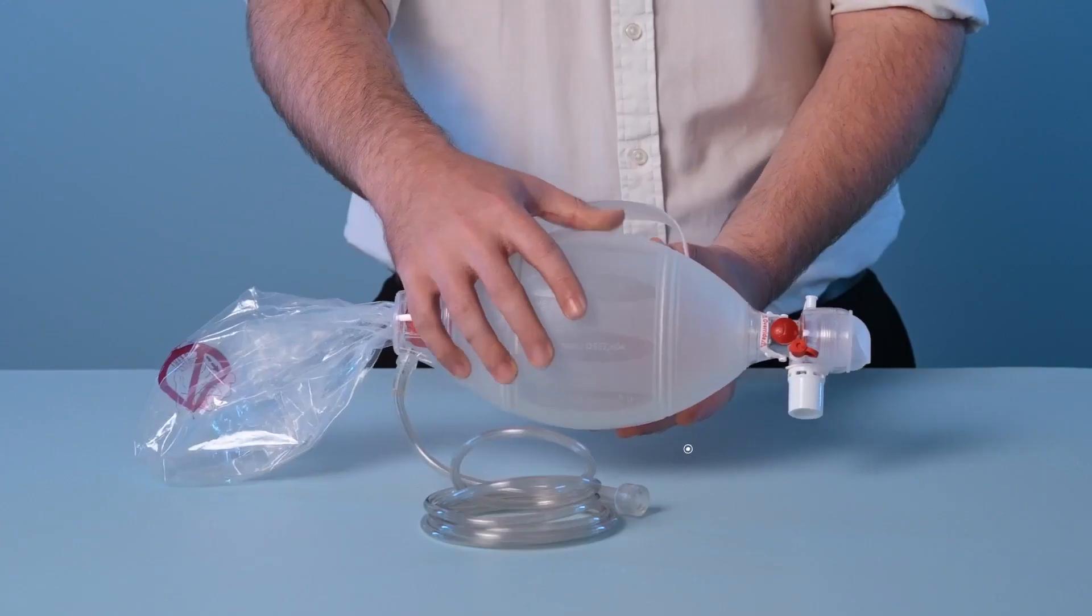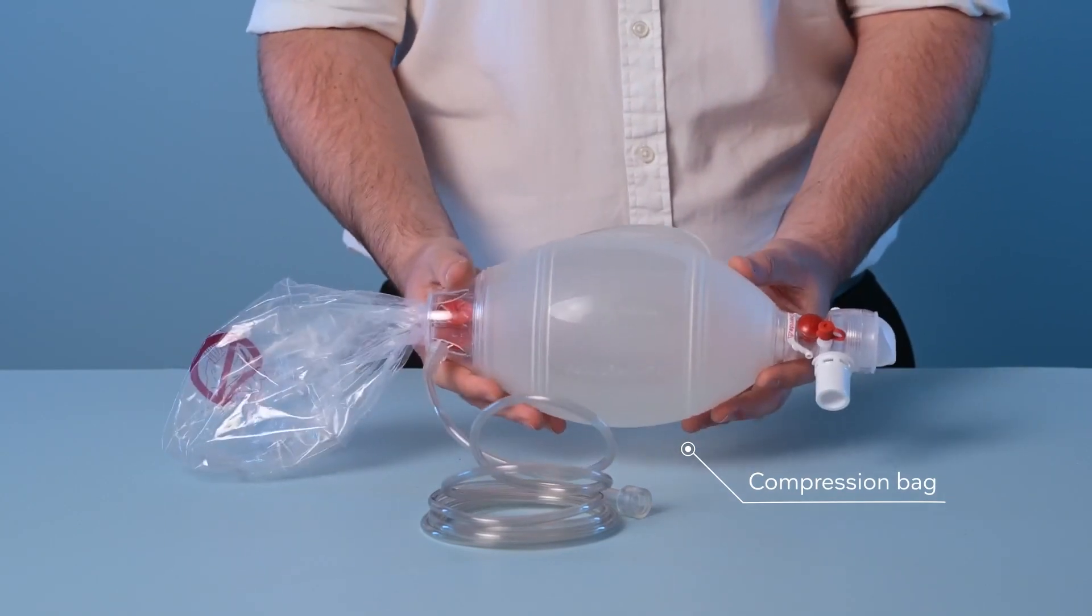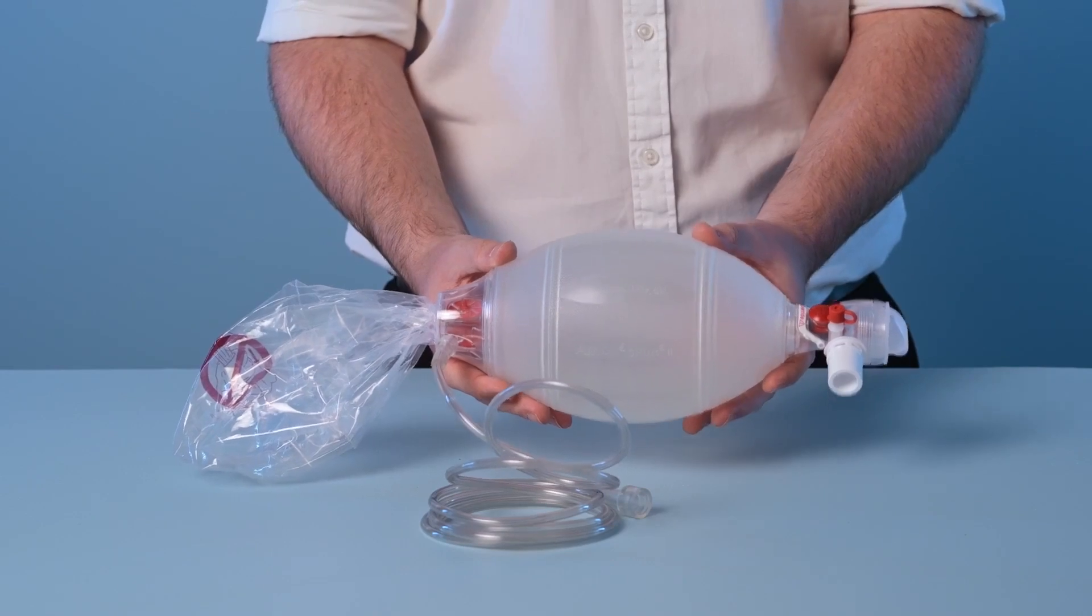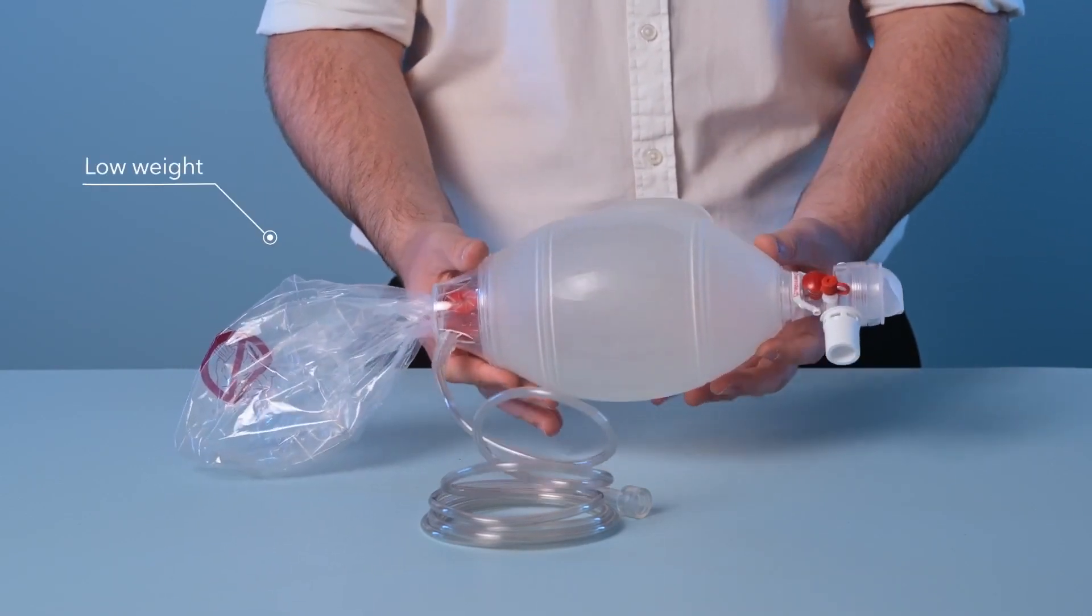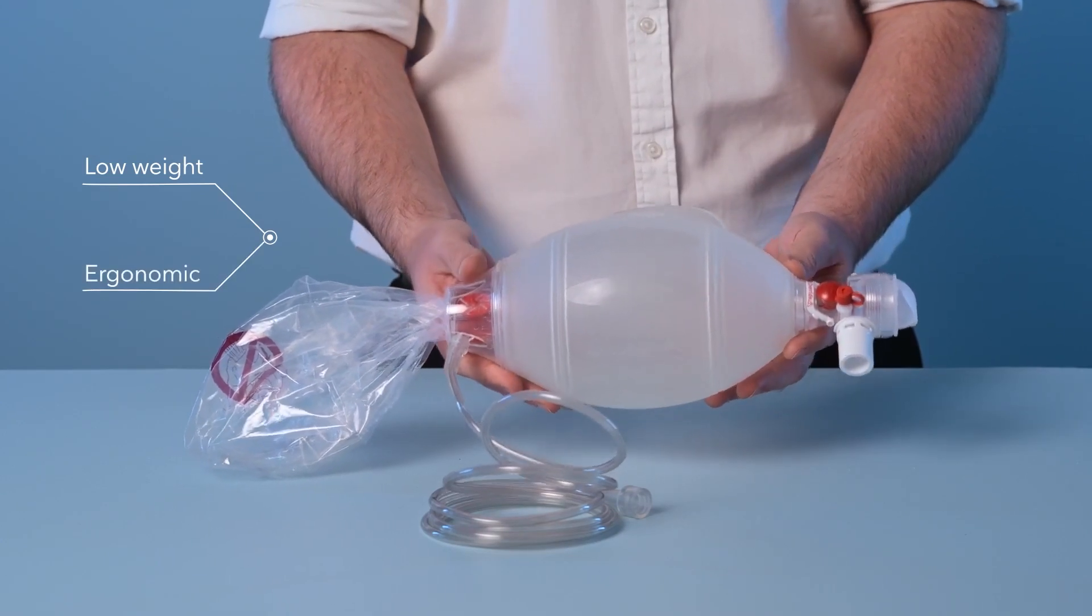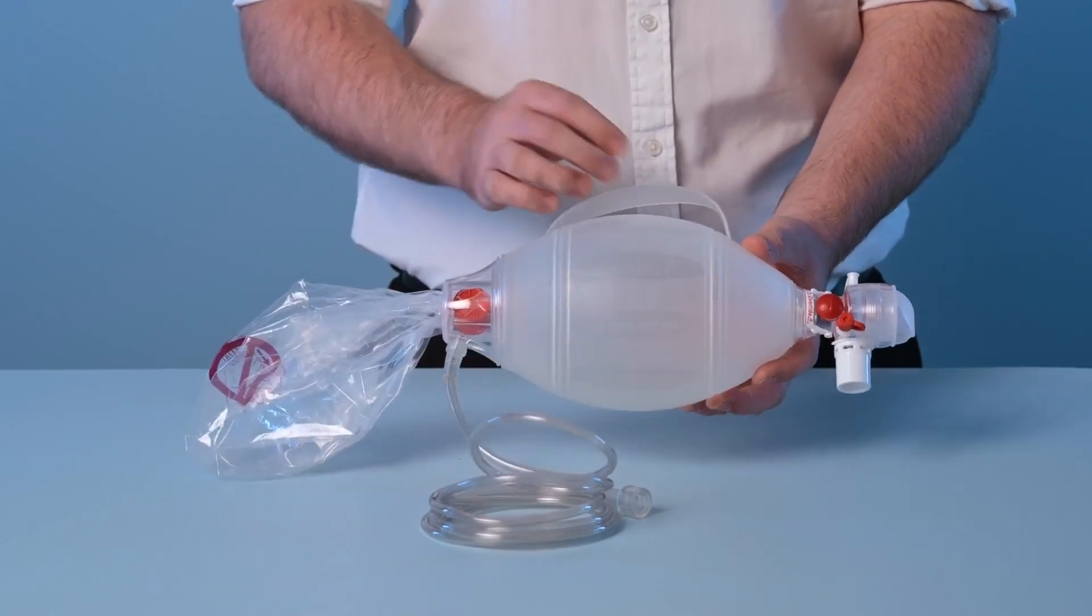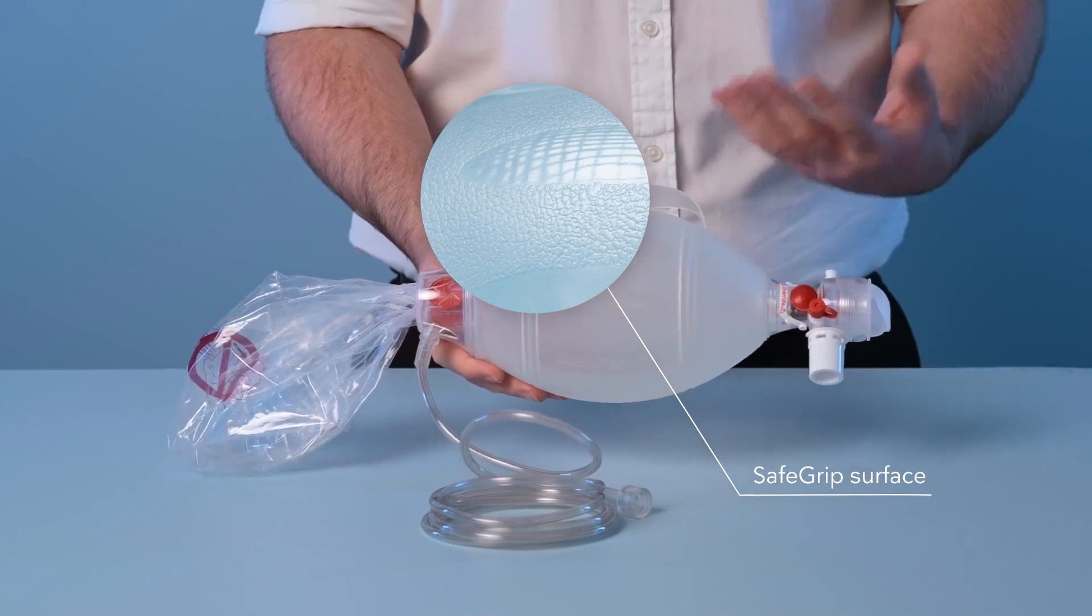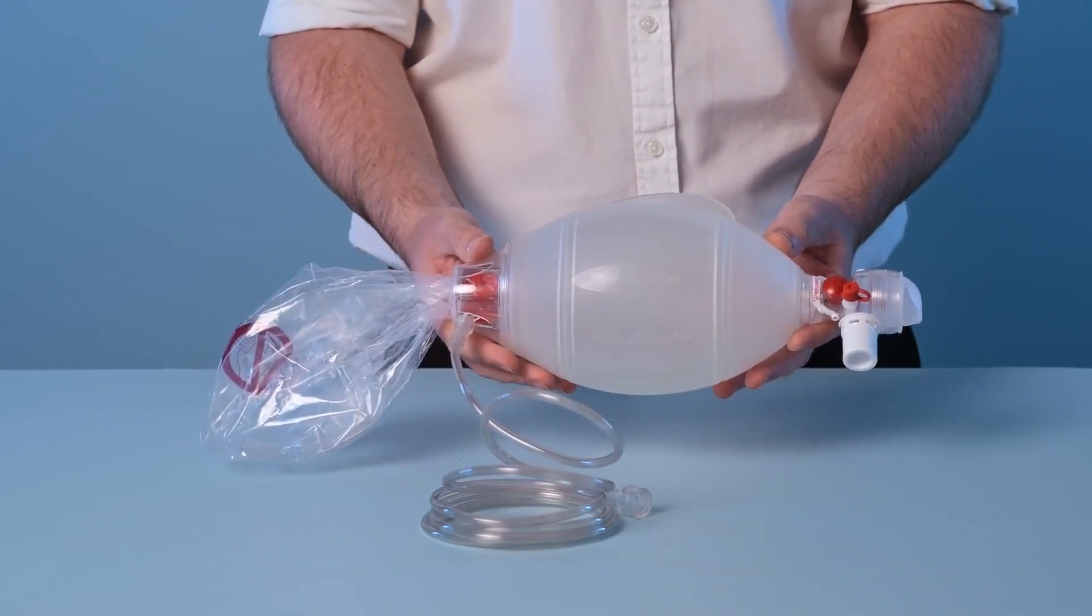Next we have the compression bag. This bag is made from a thin SEBS material and has excellent recoil to support ventilation of the patient. The Spur2 also has a low weight and is designed to be ergonomic. The compression bag features an integrated handle and has a textured safe grip surface, both of which are designed to improve handling of the device throughout prolonged periods of ventilation.